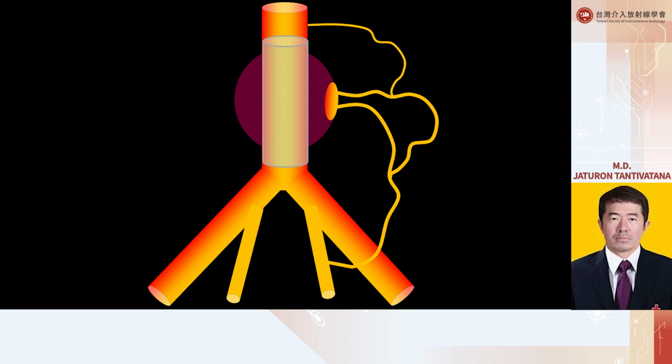In this way, we can use a microcatheter to retrogradely catheterize into the sac of the aneurysm and inject the Onyx. The same principle applies: try to obliterate the cavity with some reflux back into the other side of the retrograde feeders, so we can get the whole cavity. This one is still not finished.